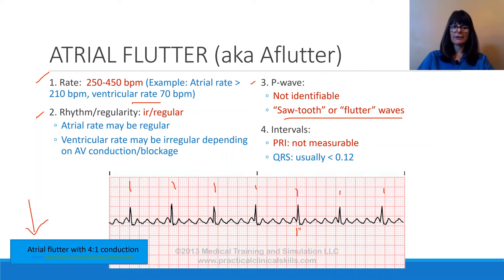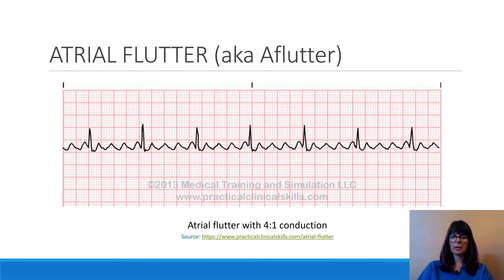This is labeled as atrial flutter with 4-to-1 conduction, which means there are four flutter waves or P waves before every QRS — one, two, three, four P waves to every QRS. Here is a bigger picture of this atrial flutter rhythm strip, and again, these classical sawtooth appearances are very hard to miss.